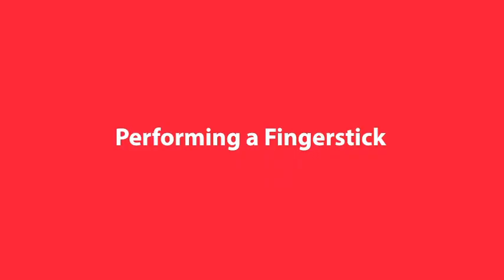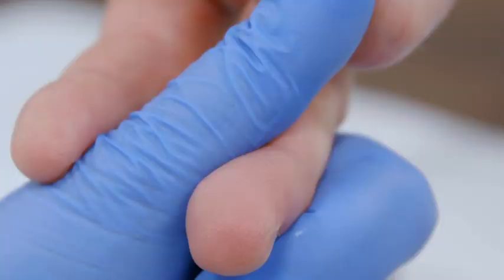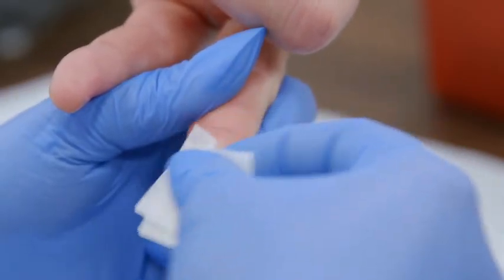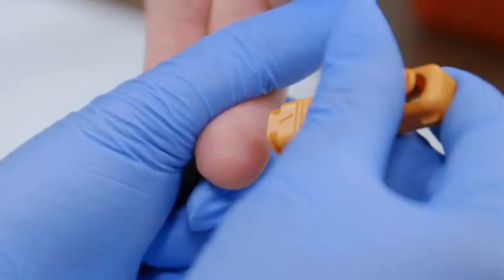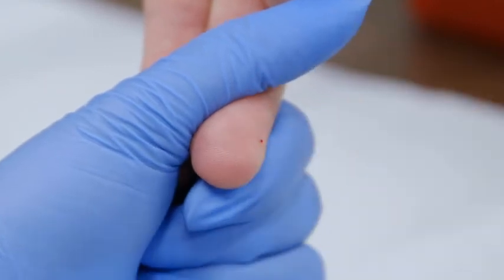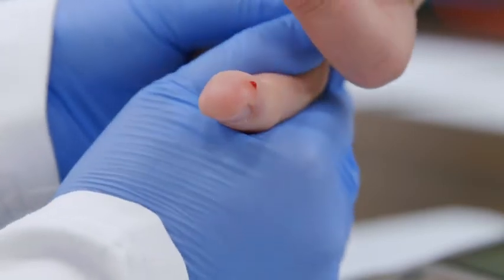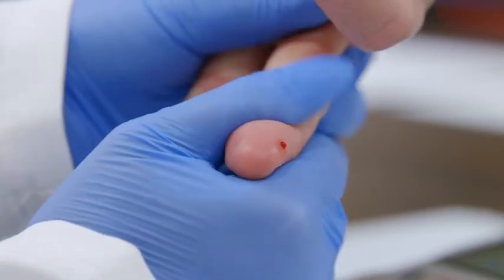Now, perform a finger stick on the patient and collect a sample. Decide whether you will collect the sample from the middle finger or ring finger — you can ask the patient which they'd prefer. Clean the finger with an alcohol wipe and make sure the finger is dry before proceeding. With a new, sterile, disposable lancet, puncture the skin on the side of the fingertip. To get a drop of blood, gently apply intermittent pressure to the finger, starting at the end closest to the hand and moving towards the tip. Do not milk the finger.